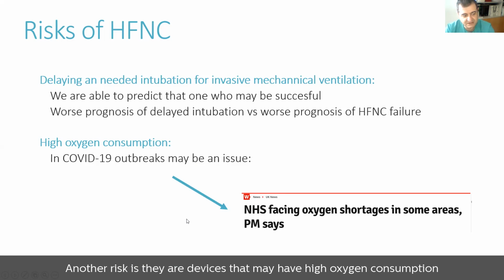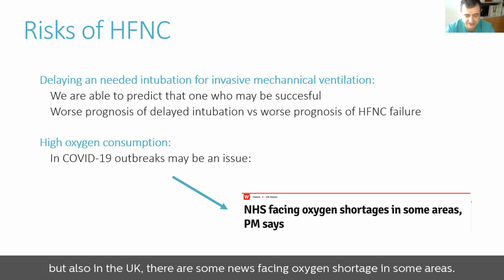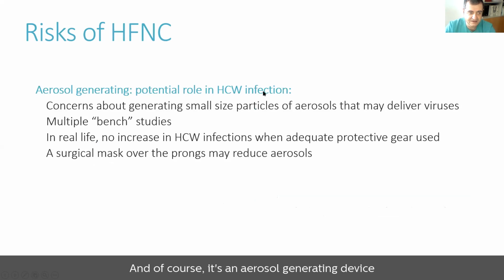Another risk is that they are devices that may have high oxygen consumption, and in a COVID outbreak, it has been an issue here in some hospitals in Spain, but also in the UK, there are some news facing oxygen shortage in some areas. And of course, it's an aerosol generating device that may have a potential role in healthcare workers' infection.